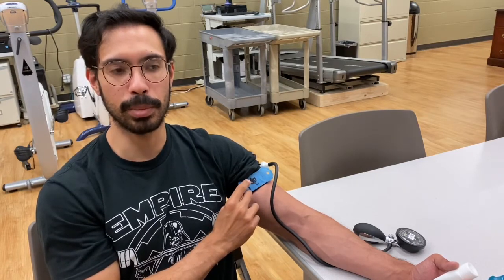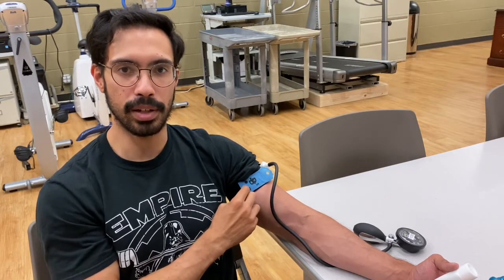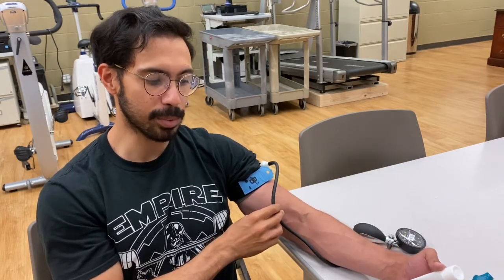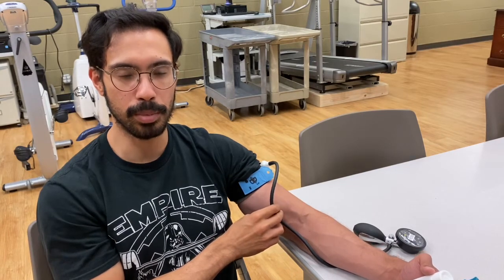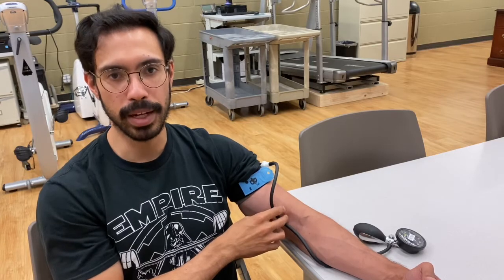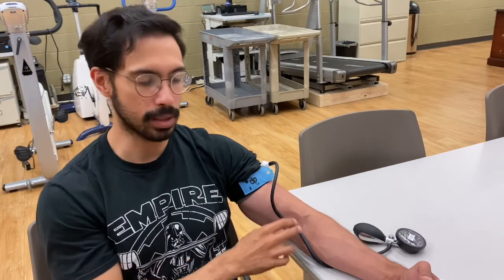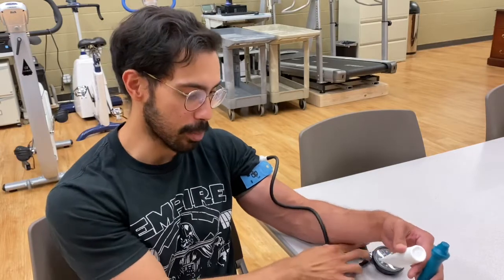You might want to go a little bit lower than that if you have any contraindications, hypertension, any of the cardiovascular diseases that I had mentioned before, or if you're just new to BFR and trying to figure out what the optimal percentage is for you in order to attain your performance benefit goals, hypertrophy, strength, maybe you're even looking for some type of muscular endurance goal out of BFR. Regardless, it's important to objectively measure your AOP.